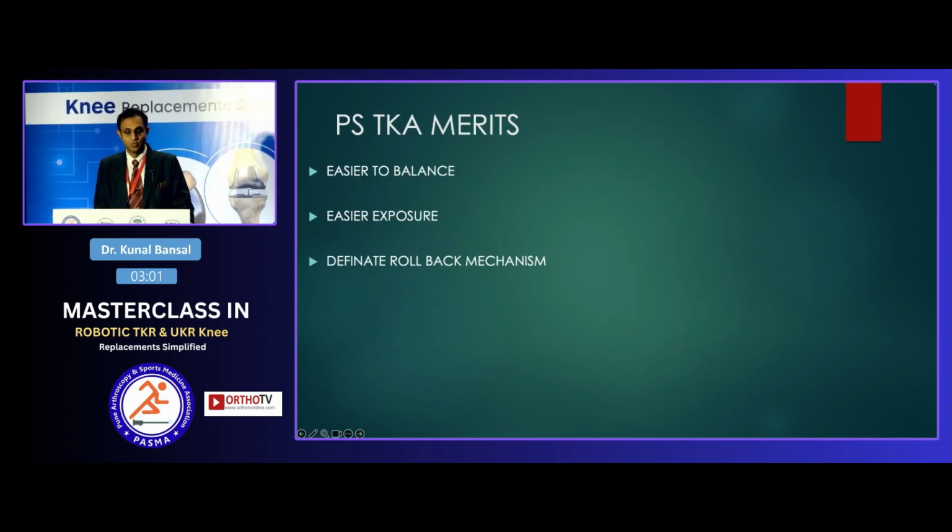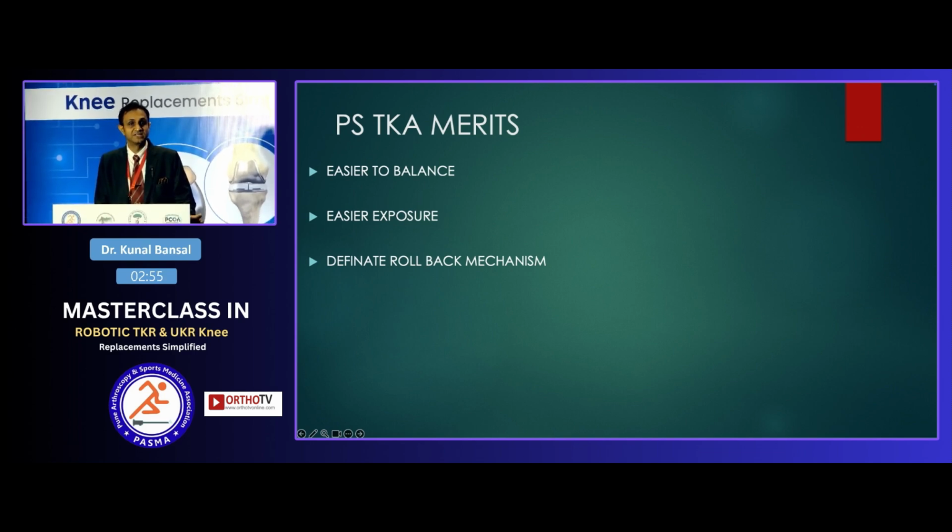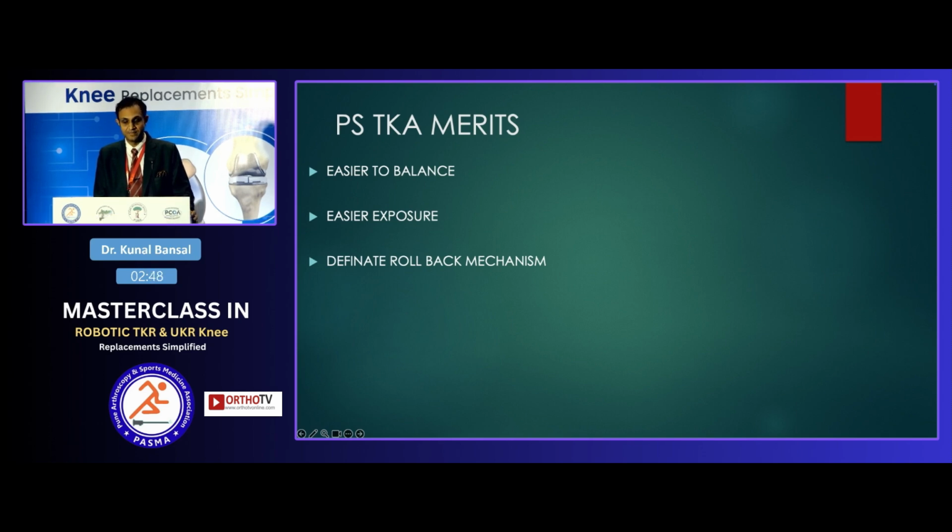So what's the merit of a PSTK? It's very easy to balance. It's easy exposure as the ACL and PCL are completely removed. And as I said, there is a definite rollback, even though it's less.